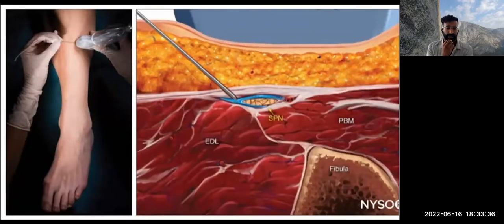Okay. In the superficial peroneal nerve, the landmark is the fibula. The way I was taught it was that you scan proximally up the fibula until it looks like a mountain. And then if you're a person running off the mountain and you leap off into space, you would kind of leap into the superficial peroneal nerve. I don't know if that's strictly correct, but that was the story that one of my mentors told me, and it's kind of stuck with me.